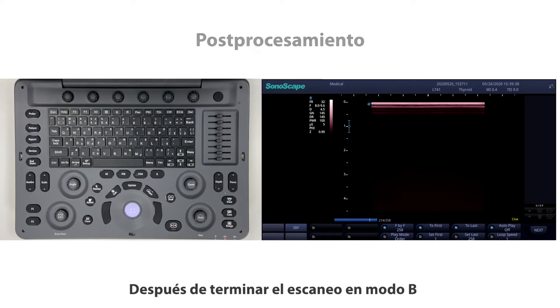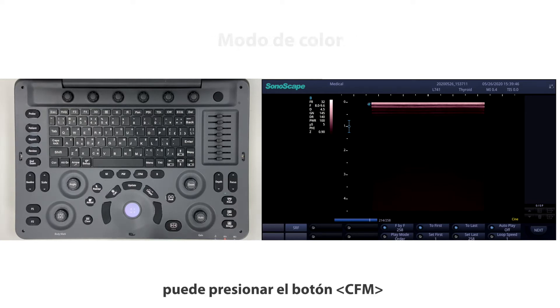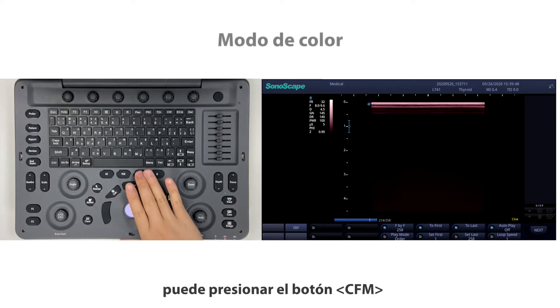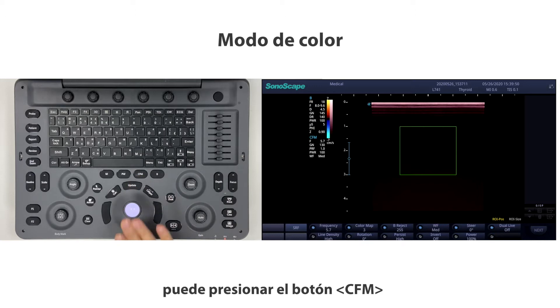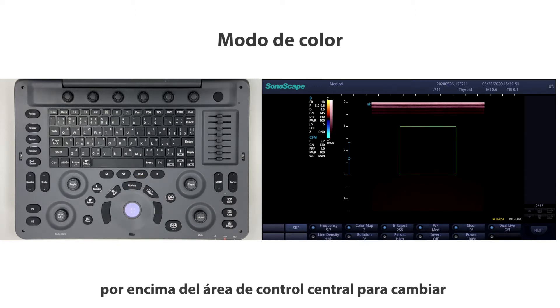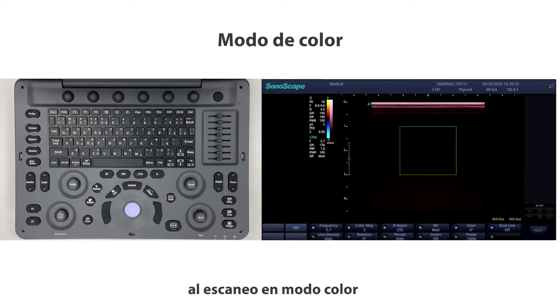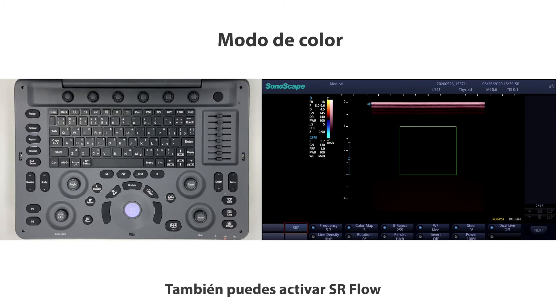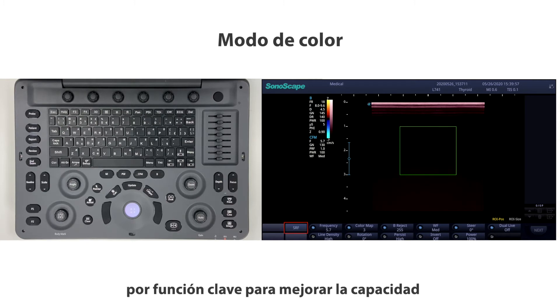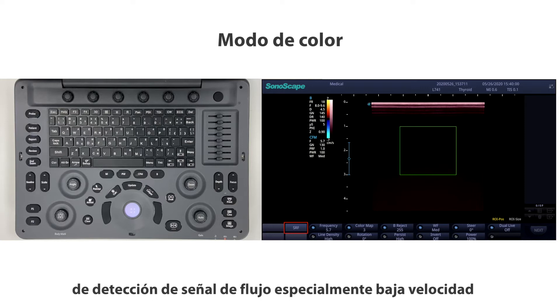After finishing B-Mode scanning, press the CFM button above the central control area to switch to color mode scanning. You can also activate SR Flow by key function to improve the capability of detecting flow signal, especially low velocity flow.